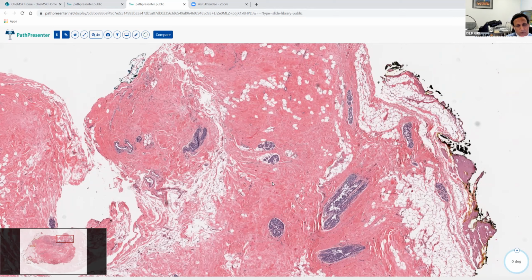And in these discussion sessions, I will harp on this a few more times as we talk about phyllodes tumor and things like that. But anyway, not to belabor this further, I was just trying to tell you that in core biopsies, if you see unusual presentation of LCIS, either extensive LCIS or the special types of LCIS, look very carefully at all the tissue because there may be very subtle evidence of invasion.